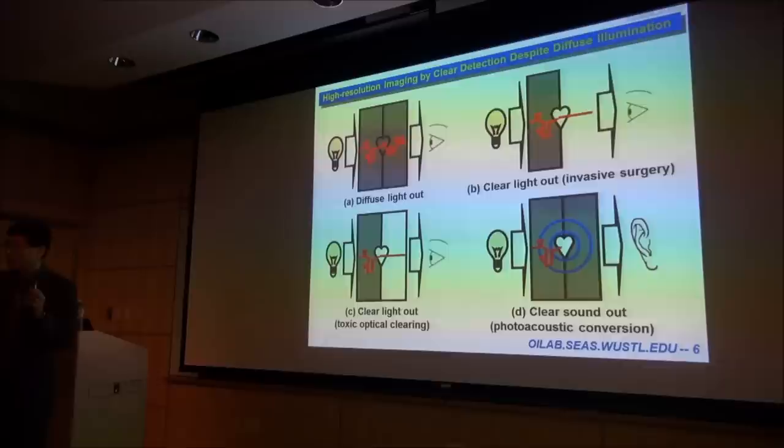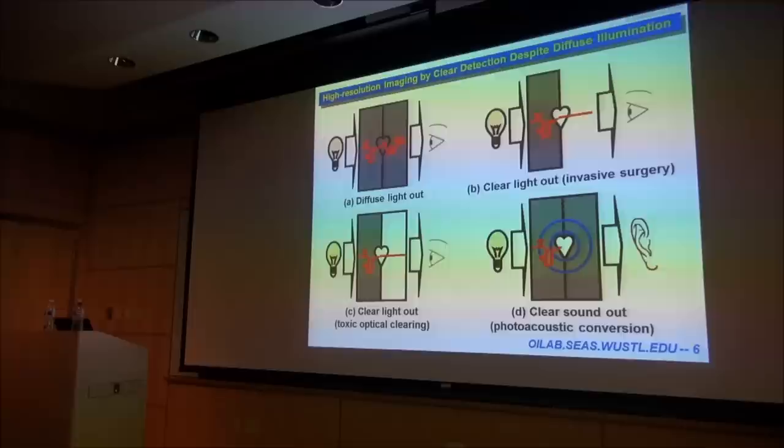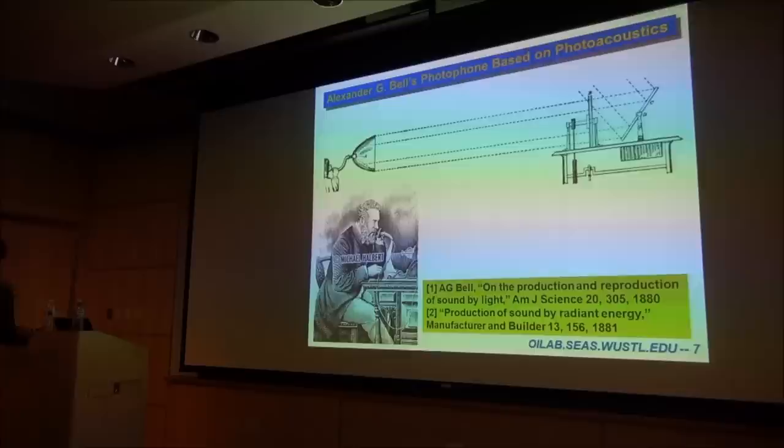So you have access to all these advantages I just talked about by using light as your probing form of radiation, which gives you all this molecular contrast. That's the advantage, because you're combining optical contrast with acoustic resolution. In a single modality, you're physically combining them. In a way, you're listening to an optical image as opposed to looking at an optical image.